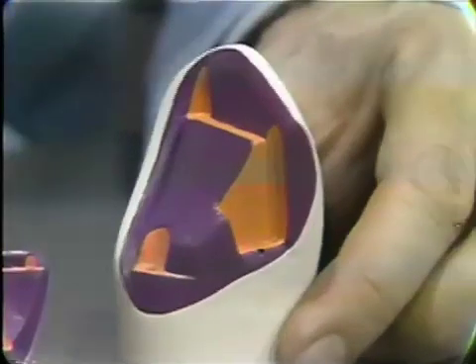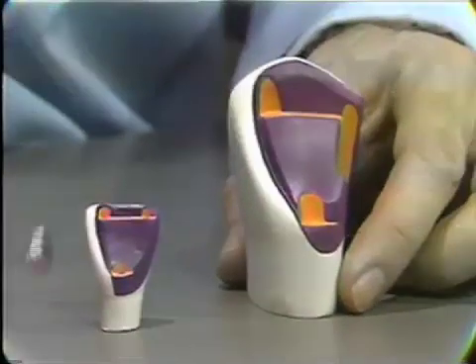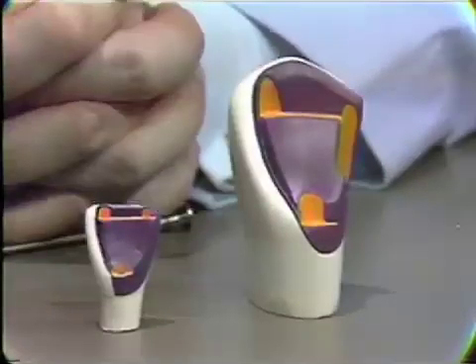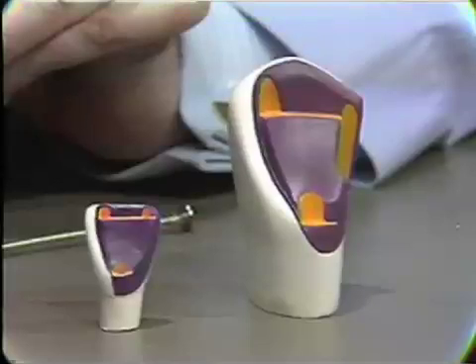And that, I think, summarizes the main characteristics of the pin ledge retainer, which, as we said, can be used on the maxillary or mandibular incisor teeth, and is replacing the use of the three-quarter crown in those situations in current practice.